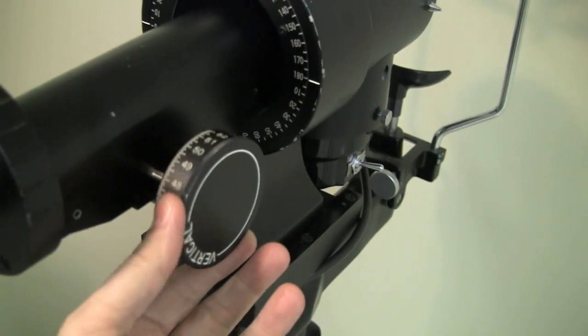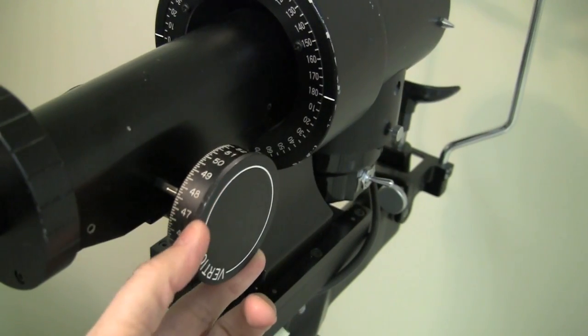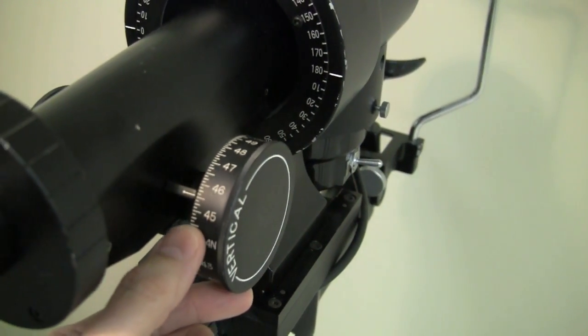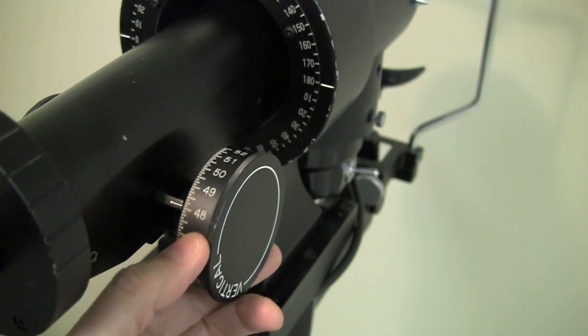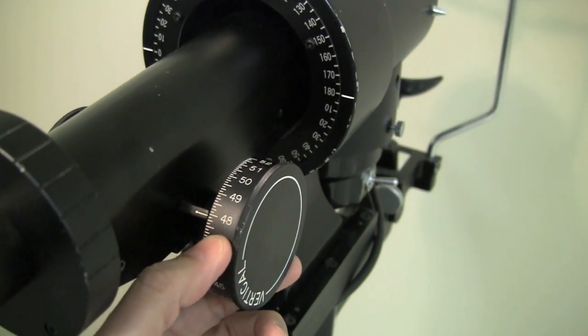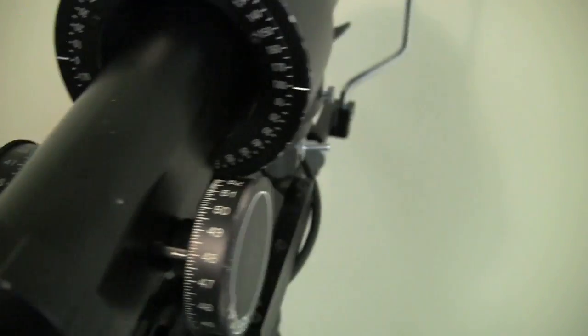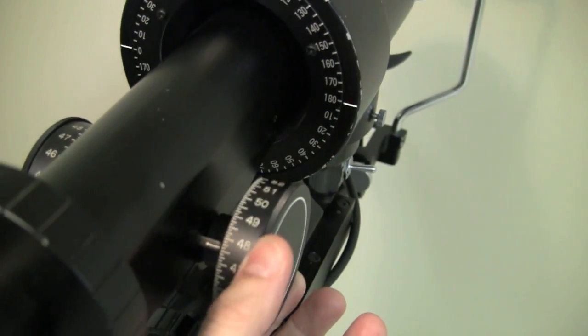You also have the knobs that you use to measure the cornea with. These are, on this one, noted in diopter values rather than millimeter values. Sometimes you see one or the other or even both. And there's one for the horizontal meridian on this side and the vertical meridian on this side.